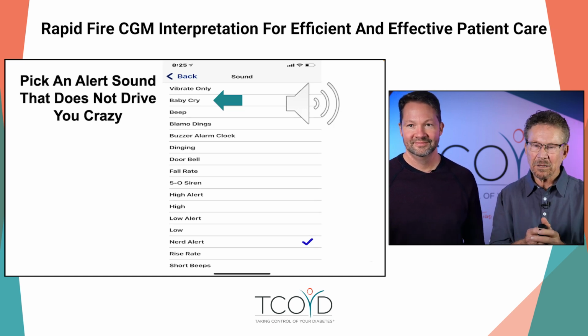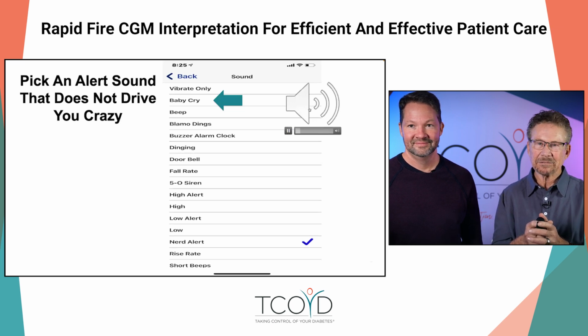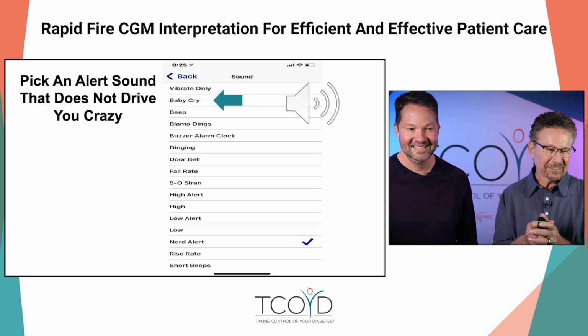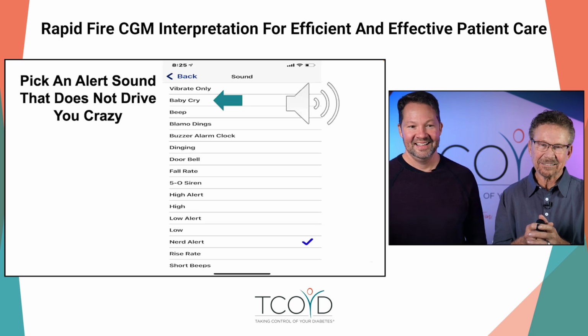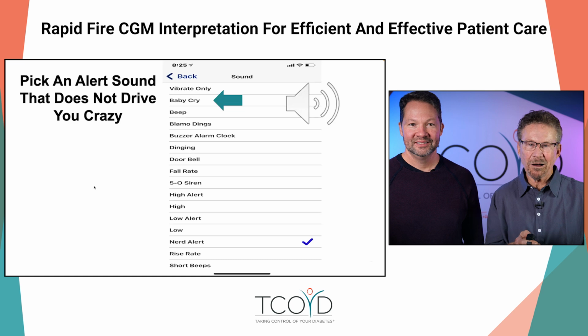Eric, can you click on that and make it go off? We'll be able to hear it. Sure. Yeah, who wants to hear that when you're high or low? But it keeps going on and on and on.